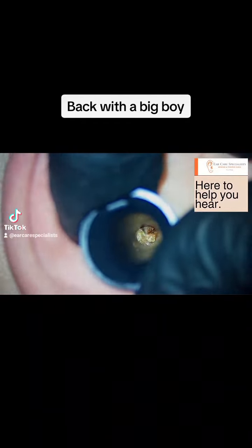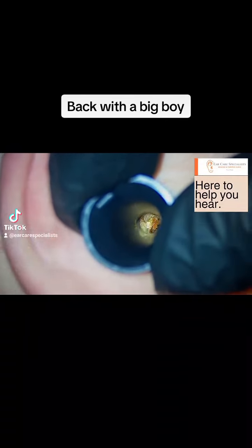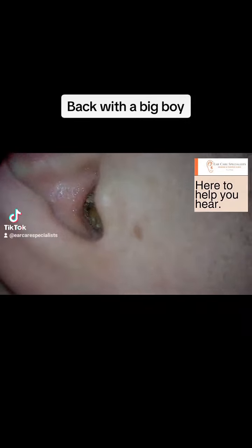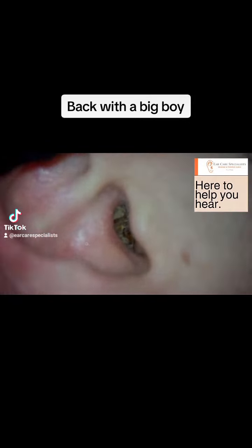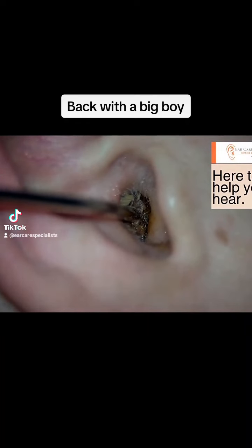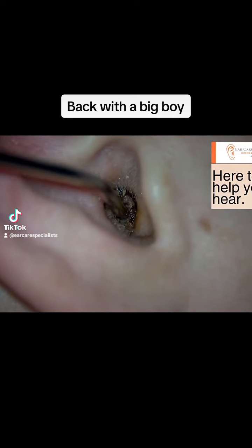So here we go. This person had lots of wax blocking both of their ears. It was quite dry and hard, so we had to use some oil, and you'll see when the speculum is removed in a moment that it covers all of the ear canal. It was really wedged in there, so this was a really nice one to remove. The patient felt much relief upon its exit.